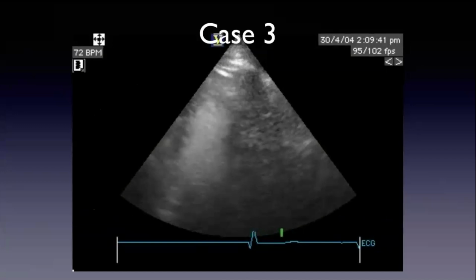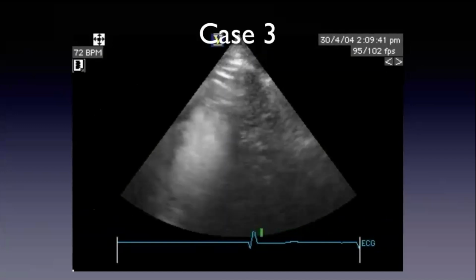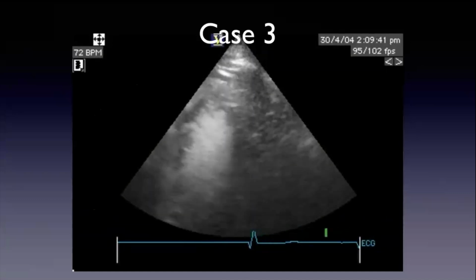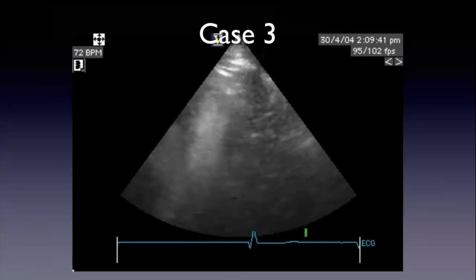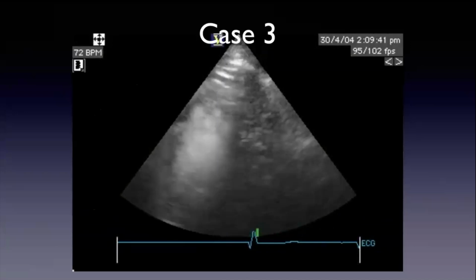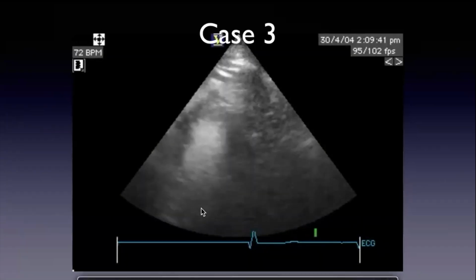Okay, so we gave contrast. The images are fuzzy, please forgive me, but do we see any abnormalities here? I'm going to show you 3 contrast zoom views. I think this is an apical 2 or an apical 3. It's not the 4. Can anybody see any abnormalities? This is wide open. Anybody who wants to jump in. Contrast is going into the myocardium there. So there's something here, like a little tongue.